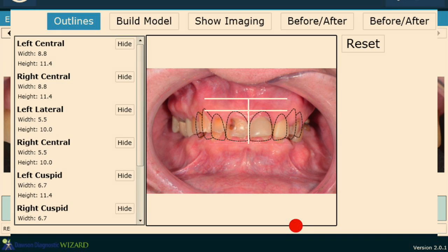And if we find our incisal edge and gingival contour, we then measure up so that we're 15 millimeters away from the incisal edge to figure out where the implants must go.